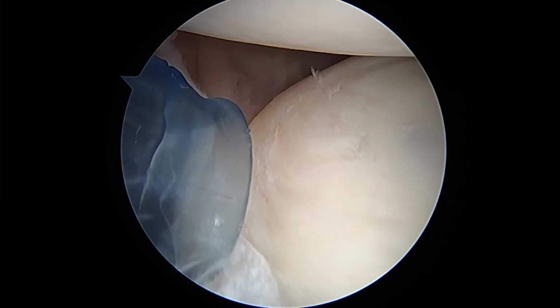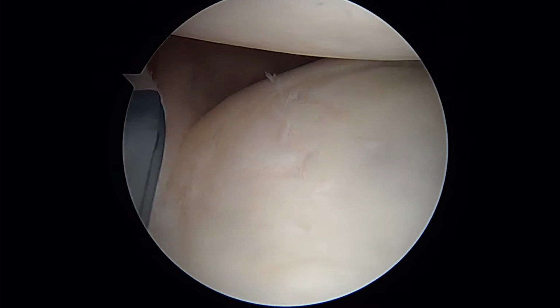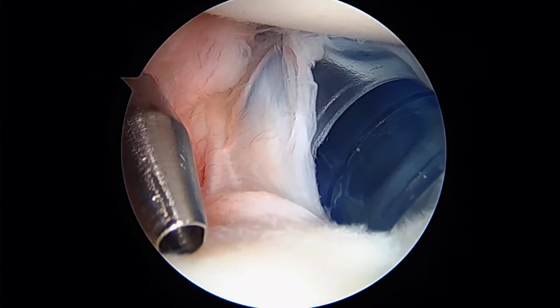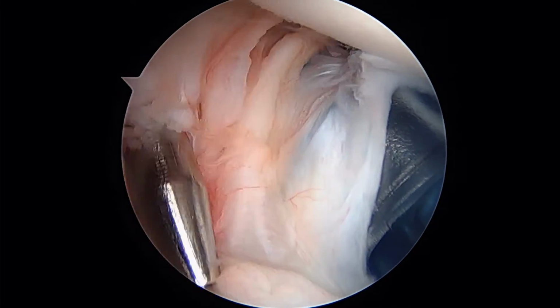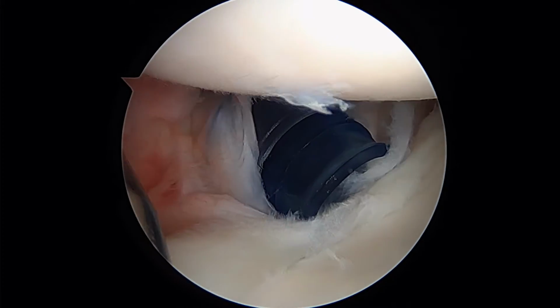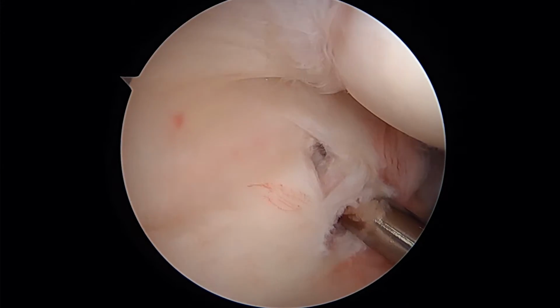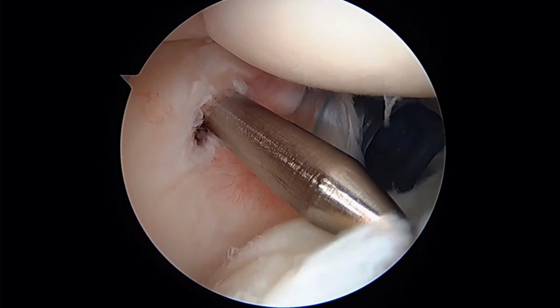So your biceps tendon, let me show you what that looks like, or what it doesn't look like here. As we look towards the front of your shoulder, your biceps tendon normally runs right around in this region here. And it's not there, it's absent. So it either tore or it was never here. I think more likely it tore based on what we know. But the biceps tendon is already completely absent from the joint. Your rotator cuff looks great. So we'll get to work and show you some more in a little bit.